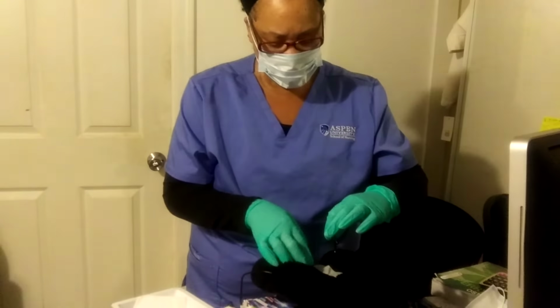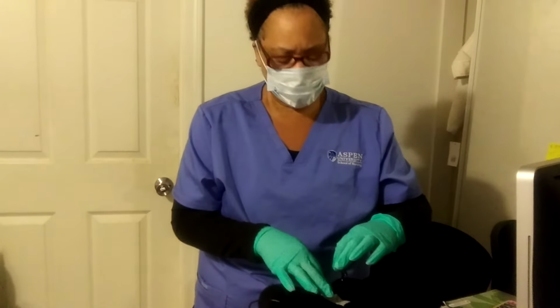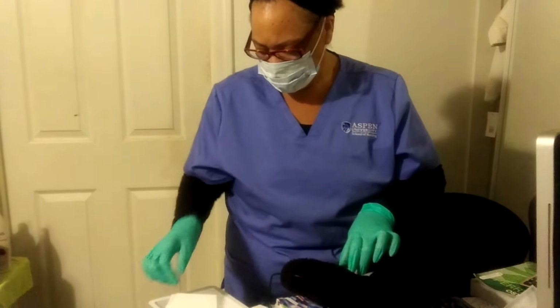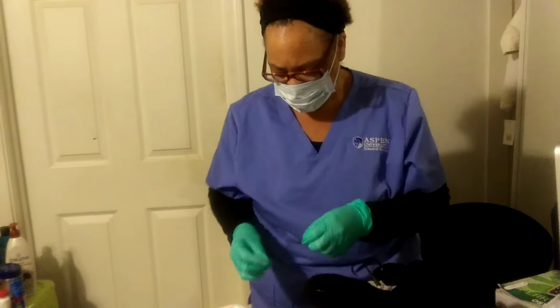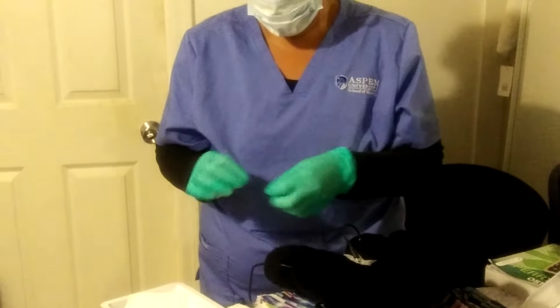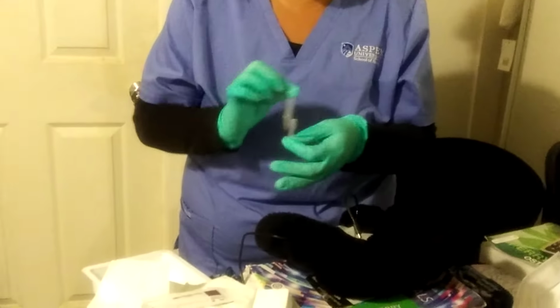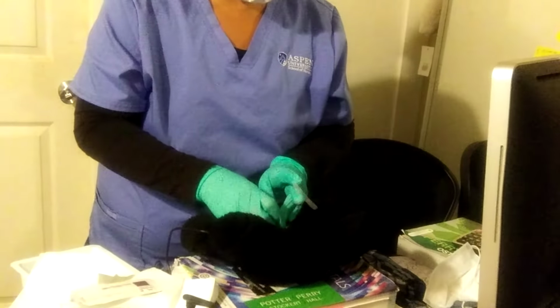Then, sometimes we use a padding called a BioPatch to put on there, which just helps reduce infection. And I recoil my tubing. And at this time too, we would place a piece of tape. So with this piece of tape, I'm going to tear it in half to use like a steri strip to anchor my tubing. So I'm going to recoil it and steri strip it down.